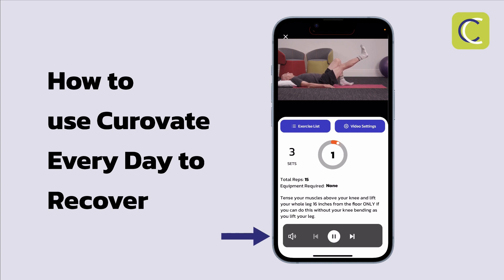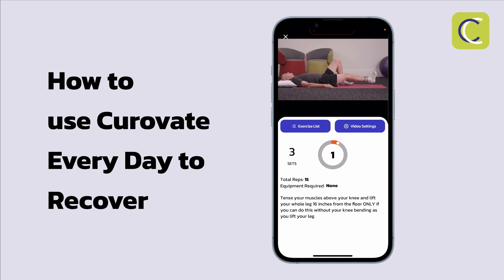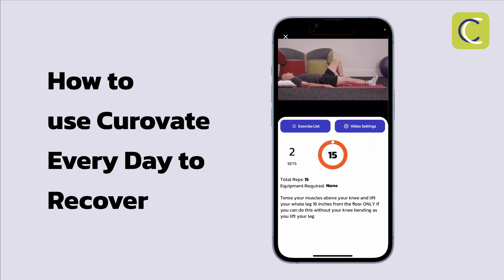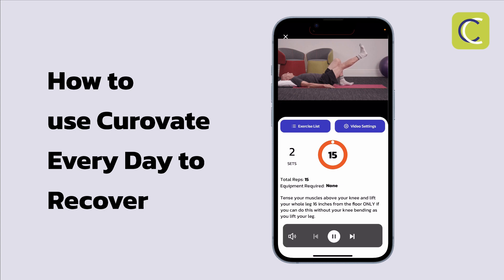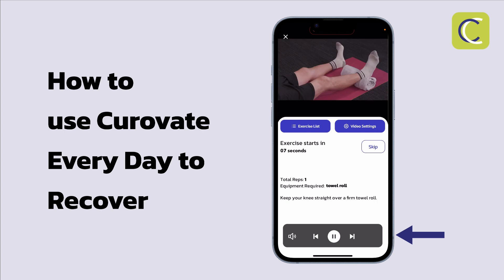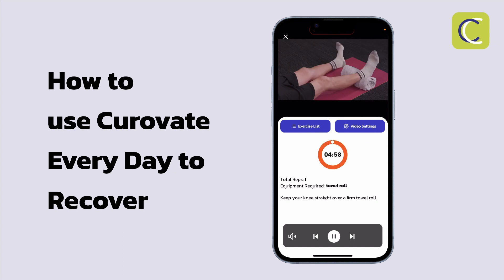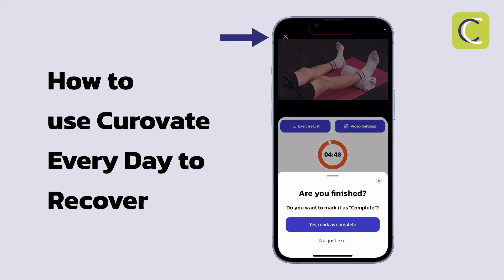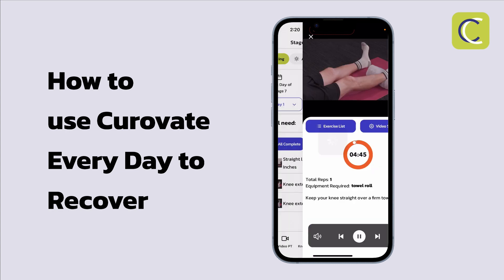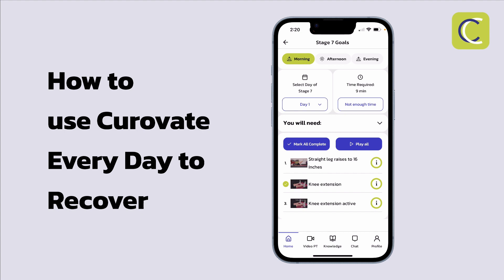On this page you can also have the audio instructions read out to you for a particular exercise by pressing the audio button at the bottom. Once the last repetition of an exercise is complete, Curovate automatically moves — three, two, one — to the next set of the same exercise. I can also skip ahead to the next exercise, such as knee extensions. For example, this exercise involves hanging out with legs straight over a towel for five minutes. If I exit the screen, I have the option to select that yes, I've completed this exercise, and Curovate will mark it as complete.